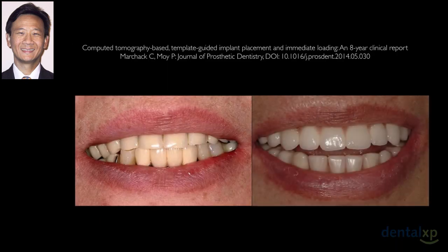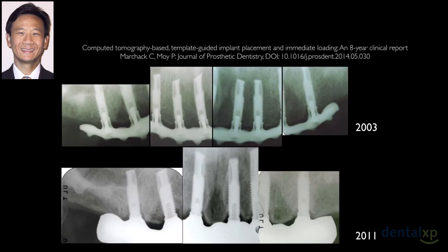This was actually submitted as a clinical report and 8-year follow-up of this patient by Dr. Moy and myself, and will be released for publication this year. But what is interesting is the quantity of bone of this prosthesis with the immediate load restoration, and 8 years later, where the bone levels are, 3 months after implant placement in 2003 to where it is today in 2011.